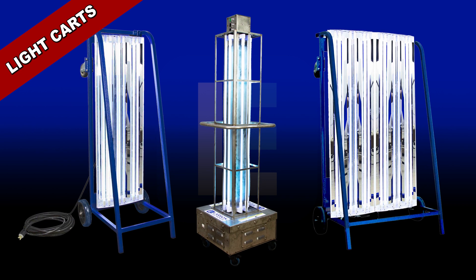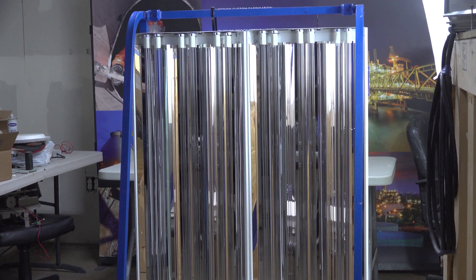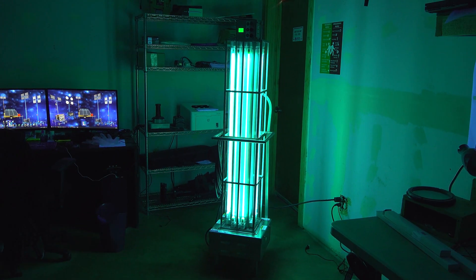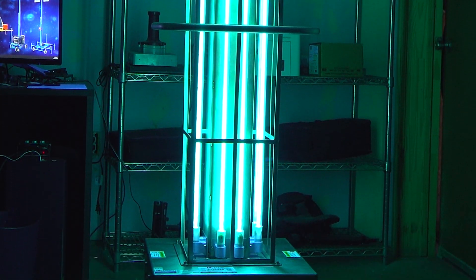Sanitation light carts. Our sanitation lights are available in dolly cart style frames with 180 degrees of coverage and industrial style carts with a full 360 degrees of coverage. The lights emit a flood beam pattern and have an expected lifespan of over 8,000 hours. With the recommended 30 minute exposure time for viruses, multiple units may be purchased to disinfect larger areas more quickly.